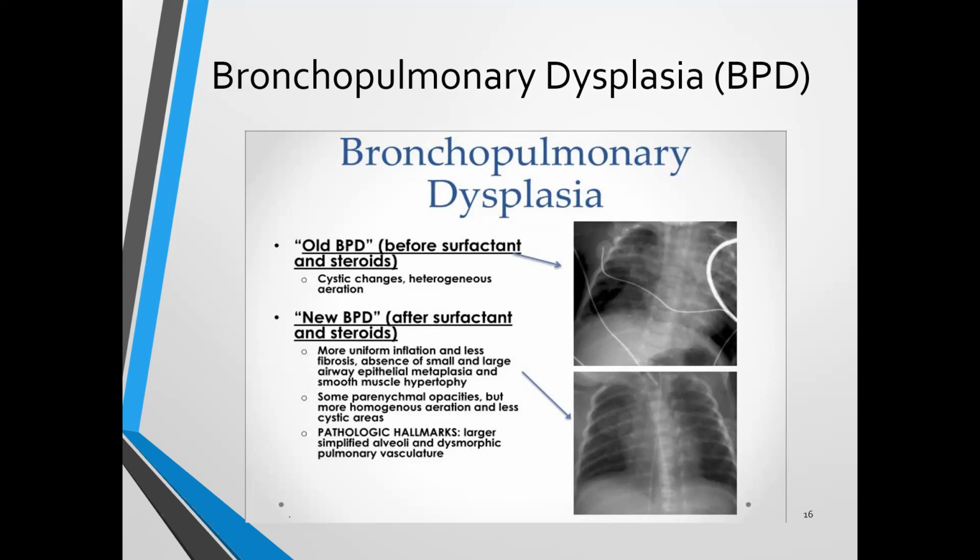And then if the baby is indeed on mechanical ventilation with surfactant administration, if they're on pressure regulated volume control forms of ventilation, you're going to get more bang for the buck for the same delta P. You're going to get higher tidal volumes. Compliance will improve. So overall, we're better able to give kinder and gentler mechanical ventilation to these kids.